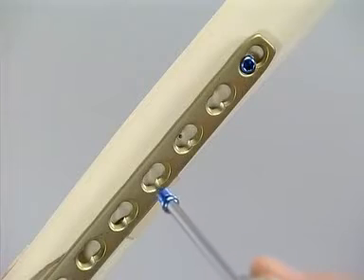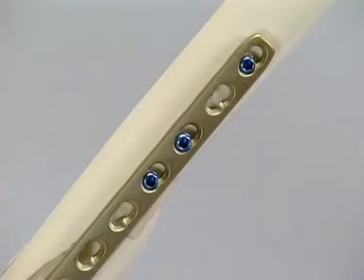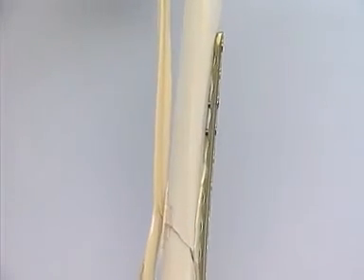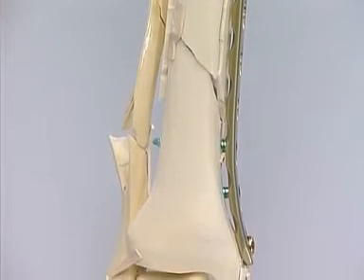The plate is stabilized in the region of the shaft with two more monocortical self-drilling locking head screws. This is the situation after completion of the internal fixation on the tibia. The fracture zone is bridged by means of internal fixation. The slight protrusion of the plate is desirable in order to prevent as far as possible any compression of the periosteum.